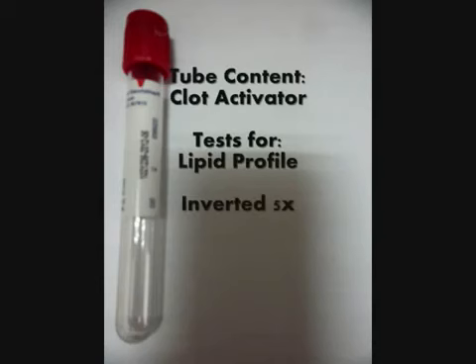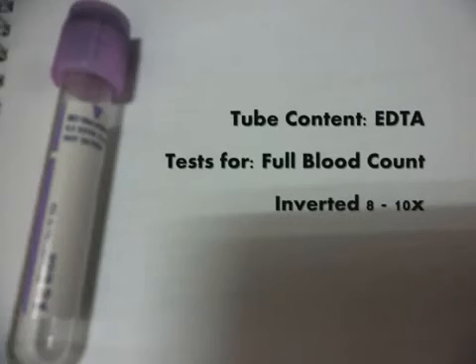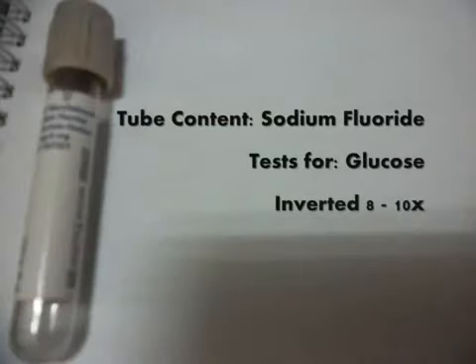The red tube contains clot activator and tests for lipid profile. It has to be inverted, not shaken, 5 times before being sent to the lab. The purple tube contains EDTA, an anti-clotting agent, and tests for full blood count. It has to be inverted 8 to 10 times. The grey tube contains sodium fluoride and tests for glucose. It also has to be inverted 8 to 10 times.